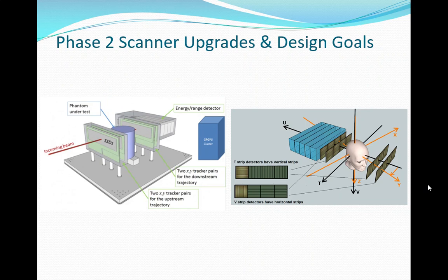All the modern systems use an extremely narrow beam called a pencil beam, and then we sweep it, just like you would with an old style TV with an electron beam. You just use electromagnetics and literally sweep and scan it. You don't do that for modern TVs anymore, but if you've ever seen those big old tube TVs, that's exactly what they did. So electromagnetic deflection, and you just deflect.